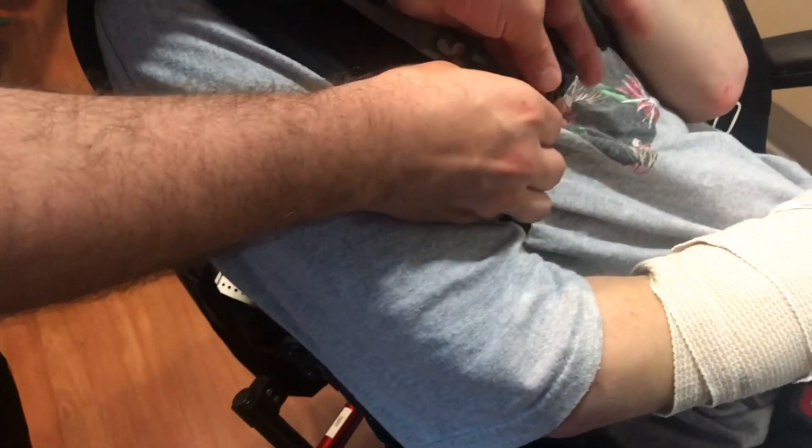Underneath his arm, attach the strap on the back first, again threading it back through the hardware on the backrest to keep it out of the way. And then attach the strap on the chest.